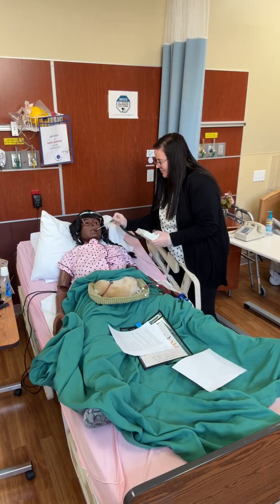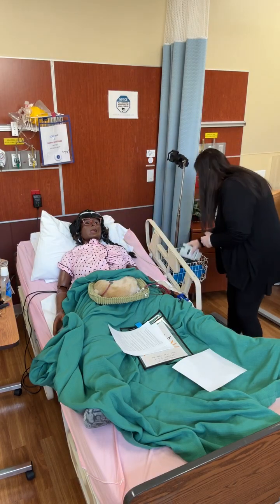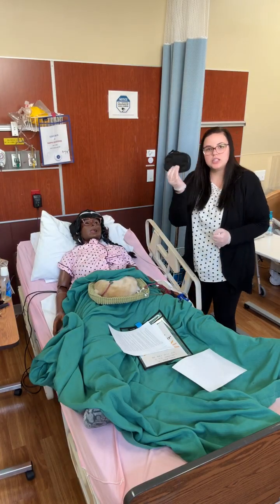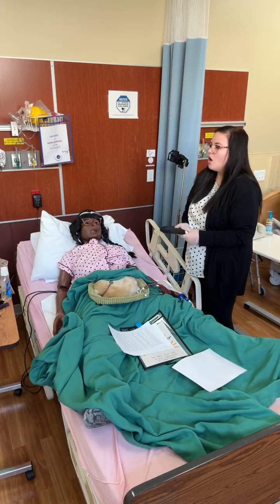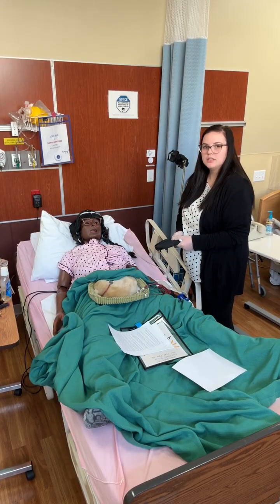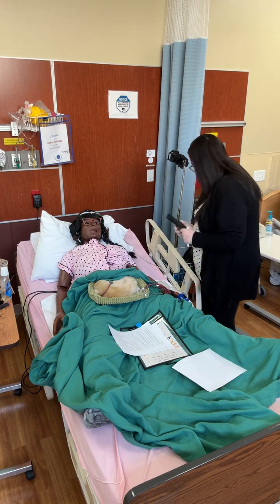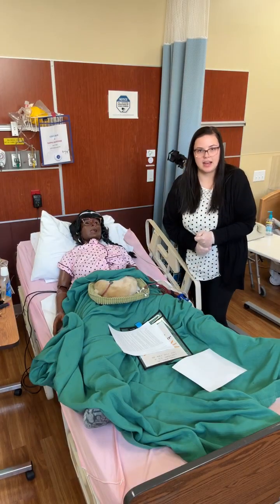Temperature is 98.6. Perfect. We will document that. And then we need blood glucose. So we're just going to take out our kit. We're going to hold it next to the patient and we'll say, sim question, what is my blood glucose? Your blood glucose is 130. 130. Okay. Perfect. So that's how you're going to obtain the vital signs.